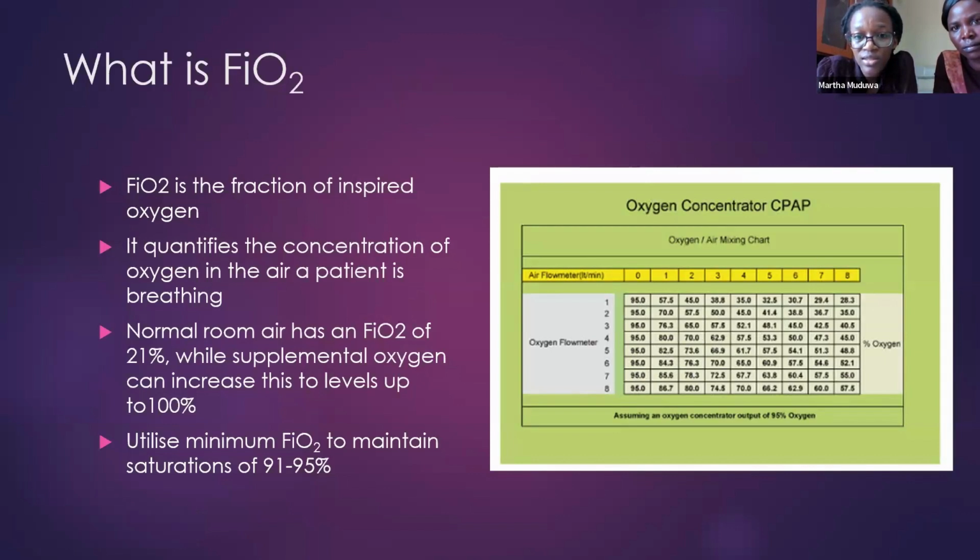76.3%. So the more you increase the oxygen, the higher the FiO2 you're delivering to the baby. The more you increase the oxygen, the more you reduce the air that you're giving, so you're giving much higher FiO2s to the baby. I hope that answers the question. Yeah, great. And the pressure?